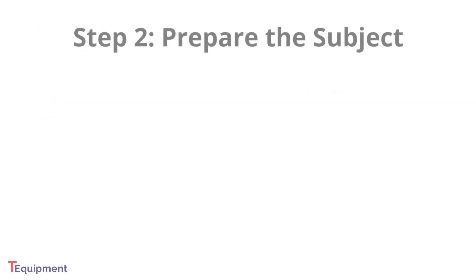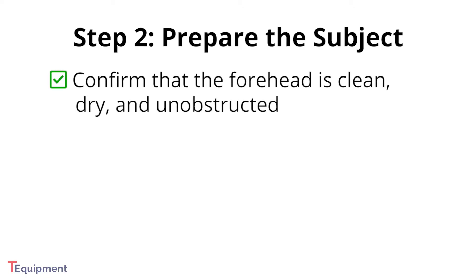Next, you must make sure the subject is ready to be tested by making sure that the test area of the forehead is clean, dry, and unobstructed.